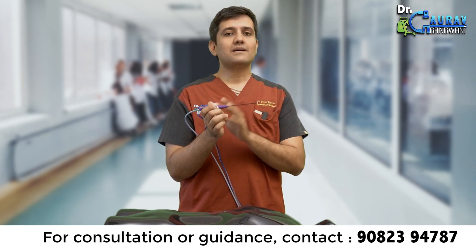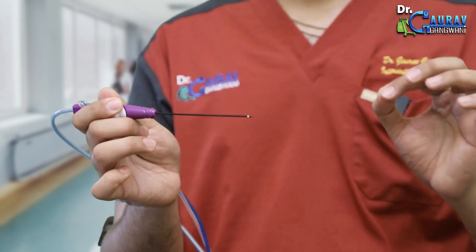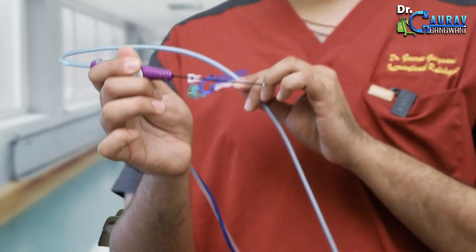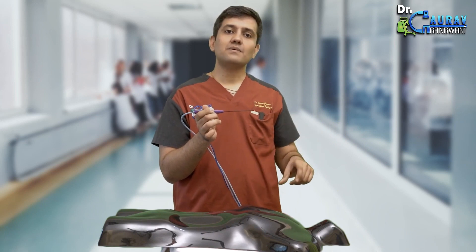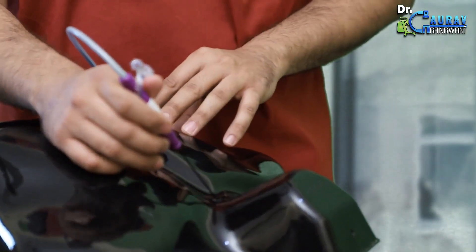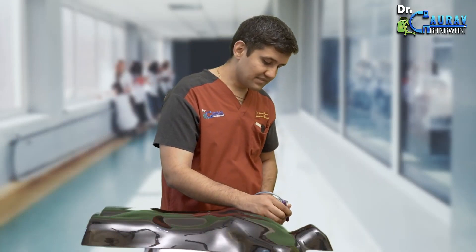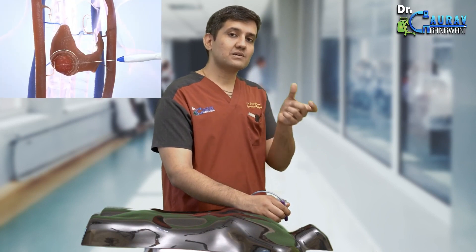My hand is also protected. The heat is very titrated and produced in a focal manner. I have connected this entire needle to a generator via a copper cable, which will send microwave energy into the needle, converting it into heat energy, and the nodule will be destroyed by the heat. I inserted this needle into the neck without any blade, just like an FNA done by your doctor. Once inserted and seen on sonography, it confirms that the nodule has been exactly reached.